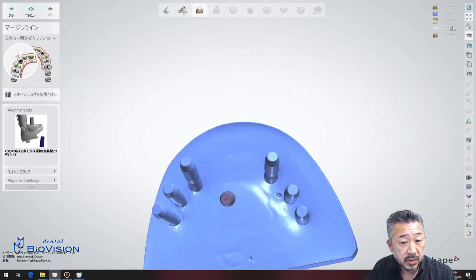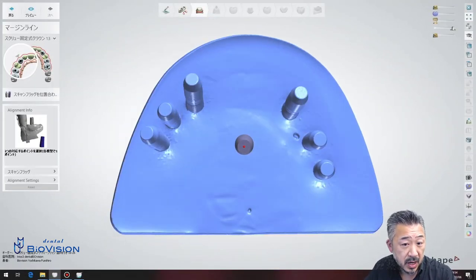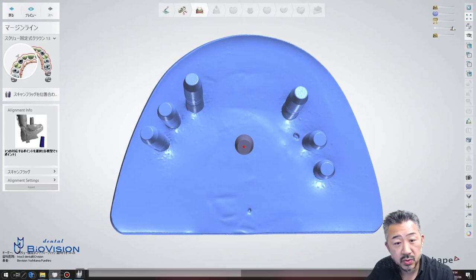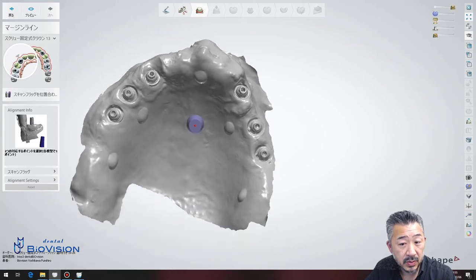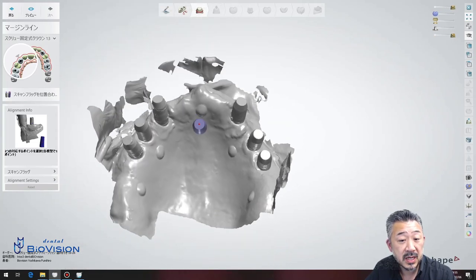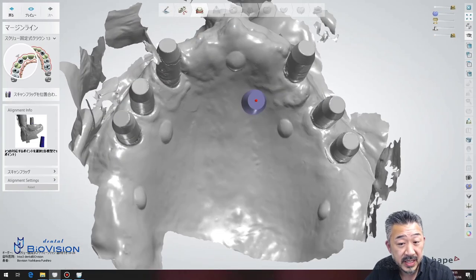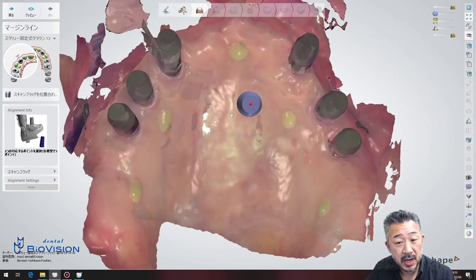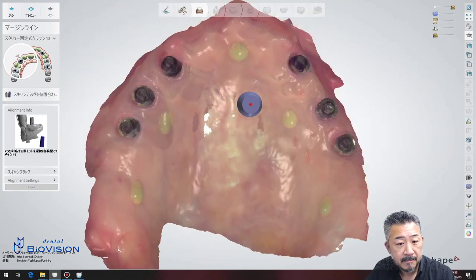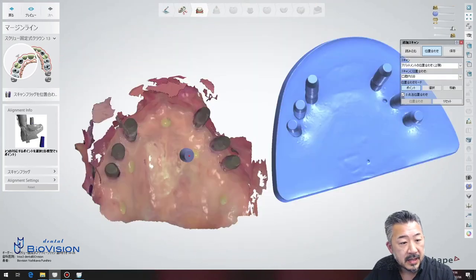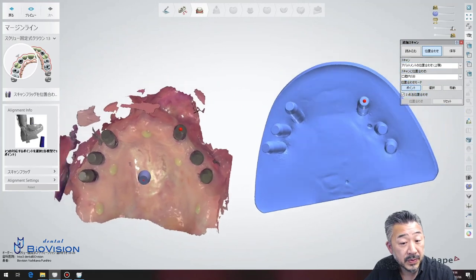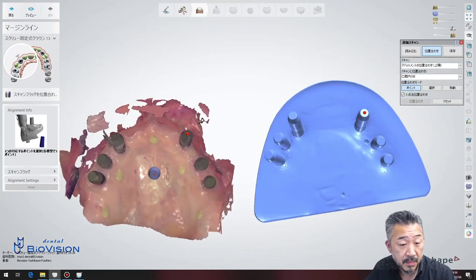The index model data imported into the abutment alignment scan — this is the blue one — is overlaid with the data taken with the scan flag in the mouth. Find the three matching points.